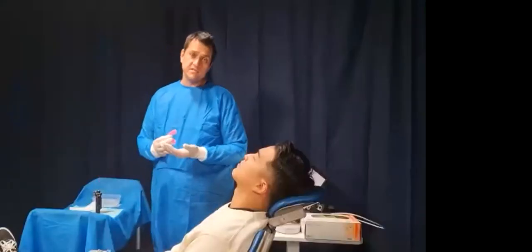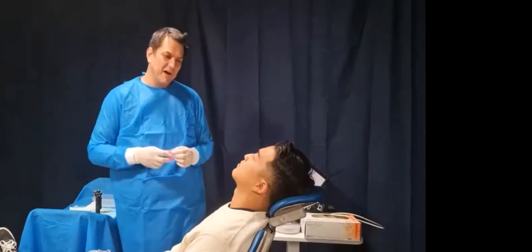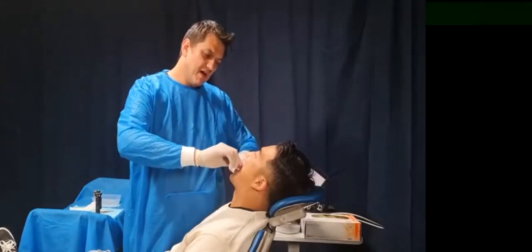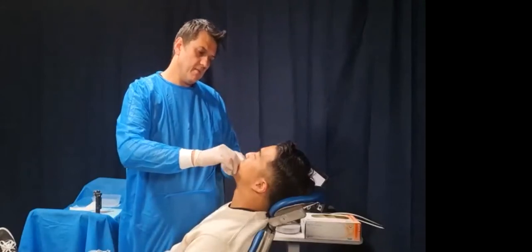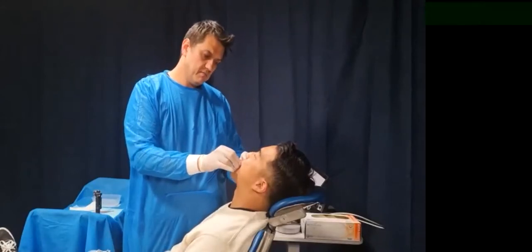Now, the good thing about having this is you can go in and out of the mouth 100 times and verify that bite. Well, probably not 100, you'll probably close the bite. But again, just opening up. I'm just checking to make sure that I'm in the right position. Close together. Okay, open. Now, close together. Mr. Cameraman, can you come back again? Sorry, just for a moment.